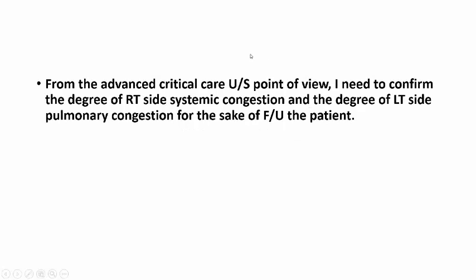From the advanced critical care ultrasound point of view, I need to confirm the degree of right side systemic congestion and the degree of left side pulmonary congestion for the sake of follow-up of my patient. At an advanced level of critical care ultrasound, you need not only to diagnose left side heart failure, but to diagnose if there is any increase in left side pressure, left atrial pressure, and whether this increase leads to pulmonary edema or congestion, and the same on the right side.